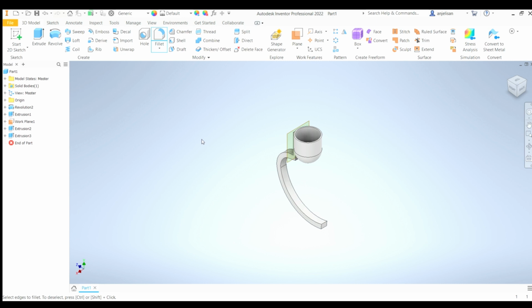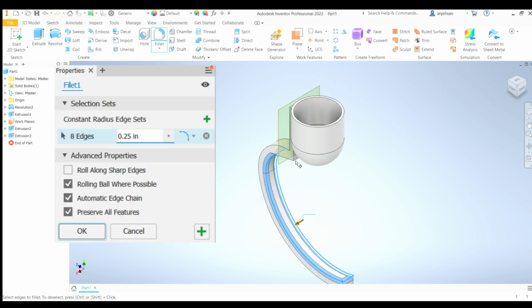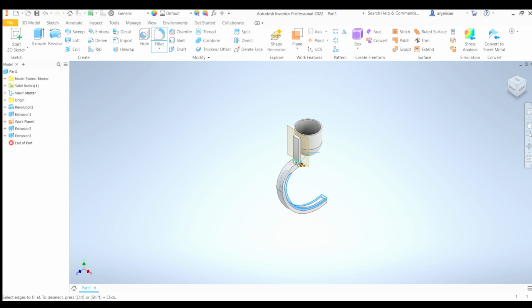Go into fillet. So let's say we want maybe 1/4 of an inch of a fillet. So that looks fine. Let's do these edges too maybe. And then let's do this edge. It looks quite sharp. And then last of all, this. Oh, actually not last of all, this one as well. So now this is looking pretty okay.